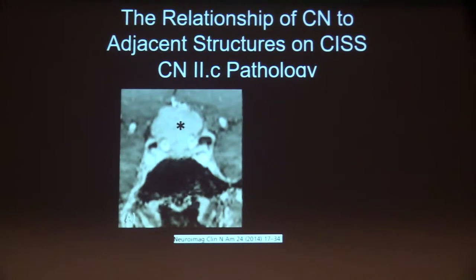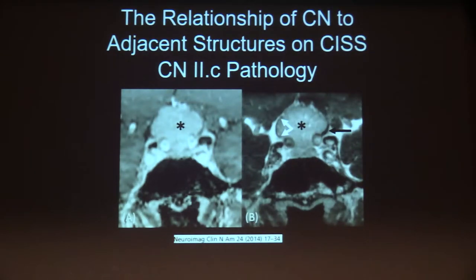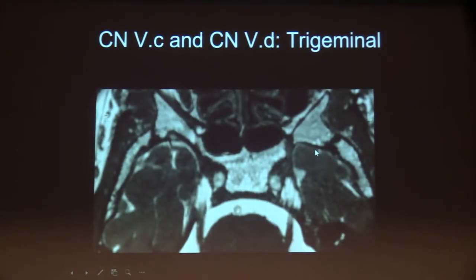We use this imaging approach extensively for operative planning. When neurosurgeons come, they often want to know preoperatively where the vital structures are adjacent to a mass. Here in the coronal post-contrast VIBE image, the asterisk is on an enhancing sellar and suprasellar meningioma, and the neurosurgeons want to know where the optic nerves are. It's hard to determine that on T1-weighted imaging, but on post-contrast CISS imaging you can see the deformity of the optic nerve adjoining the mass on both sides — useful information for surgical planning.